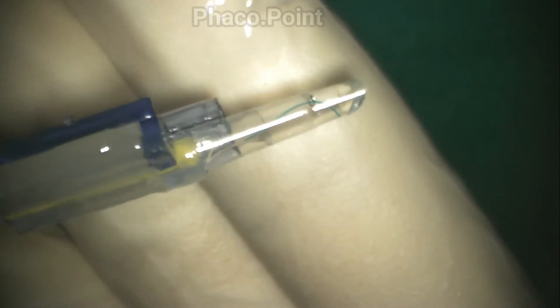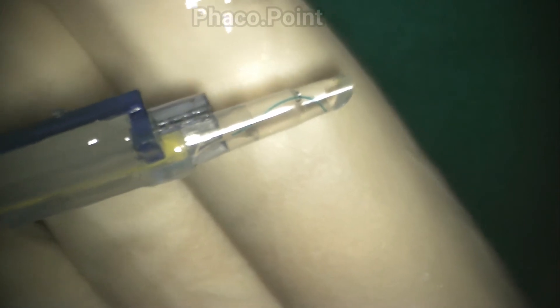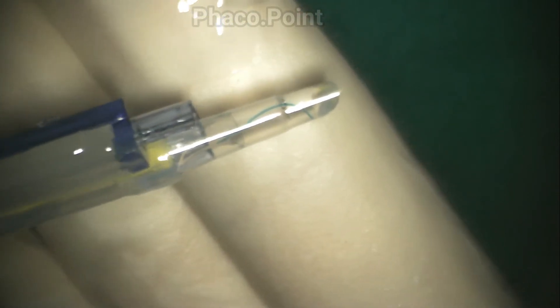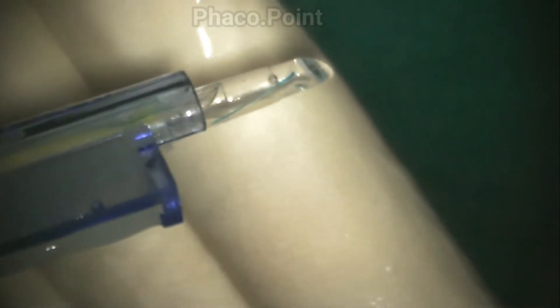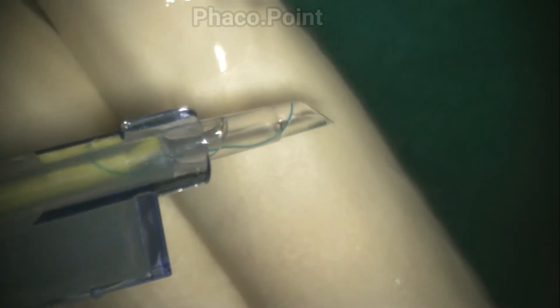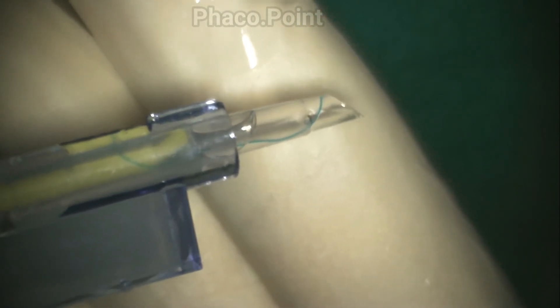The goal is to achieve a position such that the leading haptic just reaches up to but not beyond the tip of the nozzle. If it were to extrude beyond the tip in a different direction, it causes difficulty in introduction of the nozzle into the wound and into the anterior chamber. Note the position in which the leading haptic has come to lie — the surgeon in this case would need to turn the nozzle to the right once introduced into the wound.